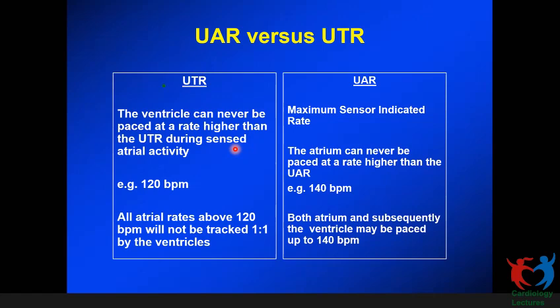If you use a single pass lead, you can do it with two leads also. And the second, like Govind mentioned, is that now it's becoming less common to find even VDD devices, or they give it at almost the same cost. But theoretically, at least, you can have a VDD device which can be a little simpler and cheaper. So you can have a cheaper device and you can use a single pass lead. Those are the advantages of VDD.